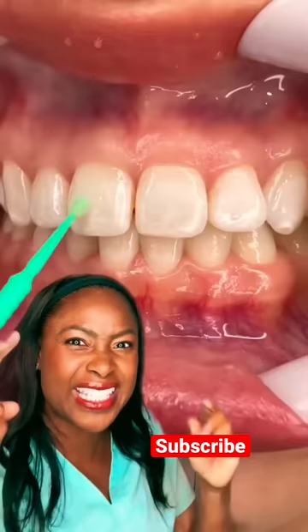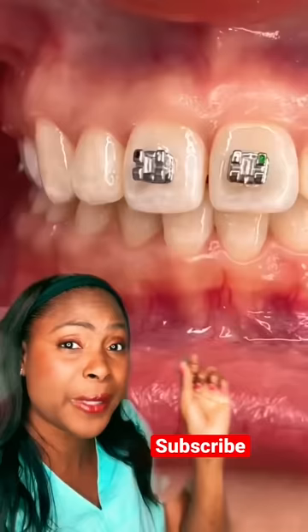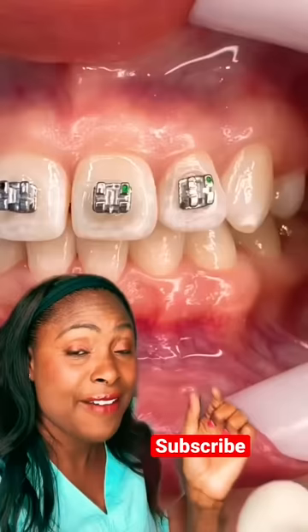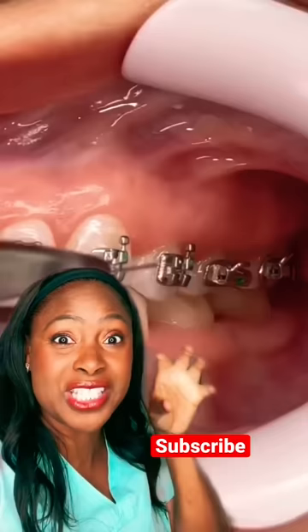They put bonding on the teeth and then light cure it. The orthodontist places the brackets on the teeth in the perfect position. After they put those brackets on, they also light cure that so it stays retained on the teeth.